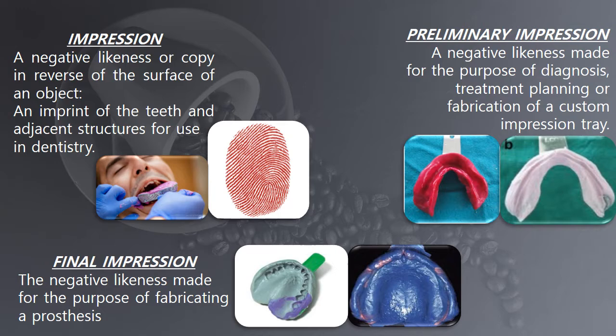For edentulous situations, in most conditions, the preliminary impressions are made with impression compound material by using an edentulous impression tray. Whereas if the clinical scenario is something different, not a regular condition, then we need to switch to another material like a mucostatic impression material like alginate.